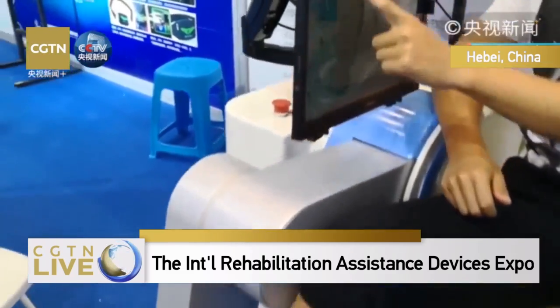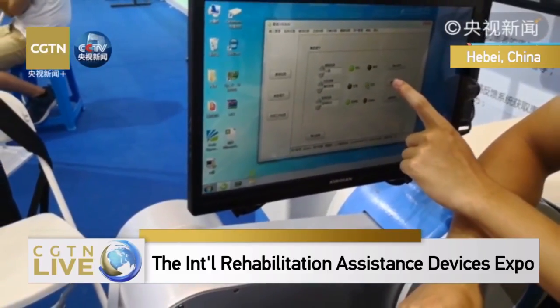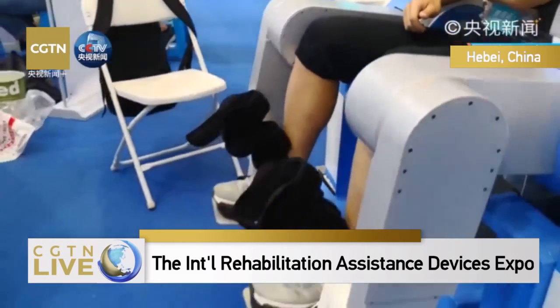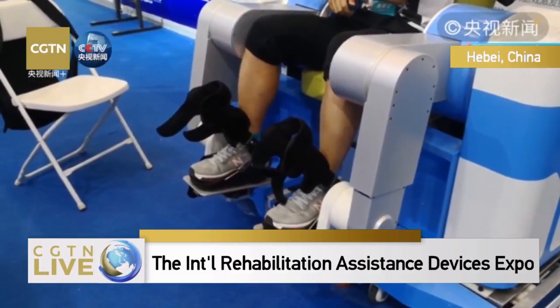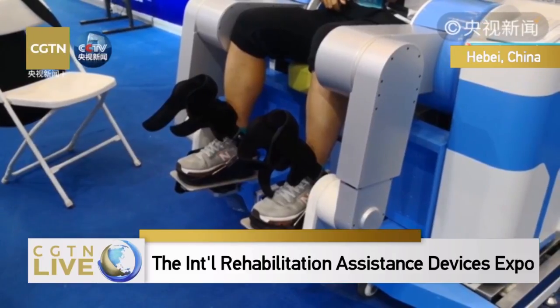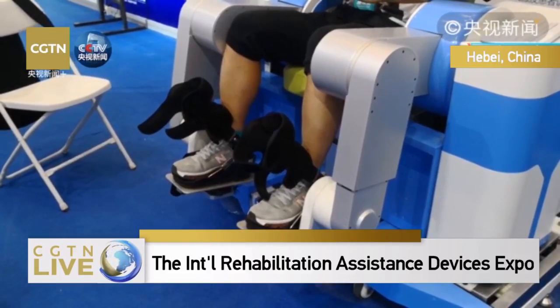This has motors, but it also incorporates smart technologies. It can strengthen or empower you. It has its own operation algorithm. When the person goes up, it can adjust its parameters according to the person sitting on it.